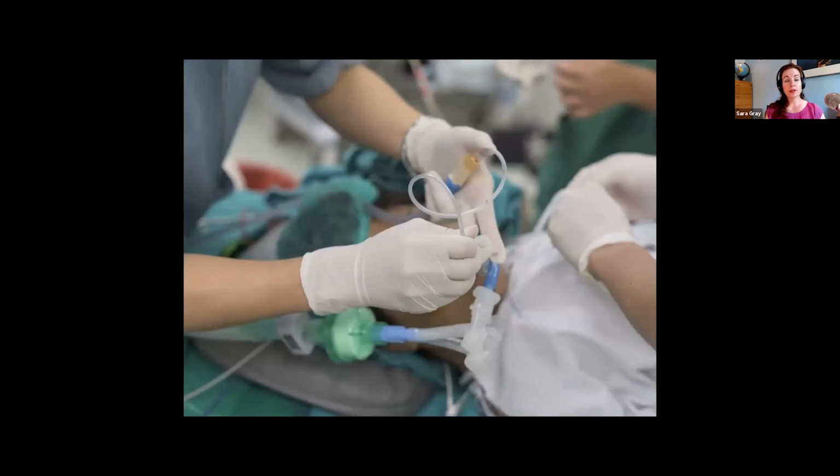Your next step is to suction the patient out. Suction in their mouth, suction down their throat around the tube, suction down the tube itself with your inline catheter. This just makes sure there are fewer secretions or mucus plugs there that your patient is going to cough out. So you're kind of doing them a favor by sucking this all out in advance.